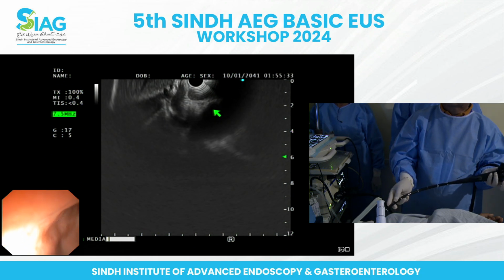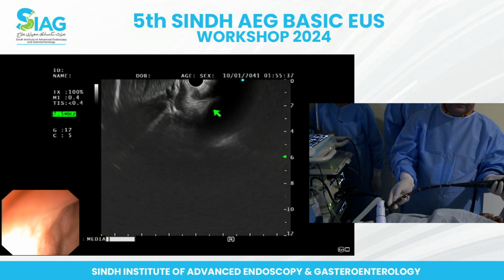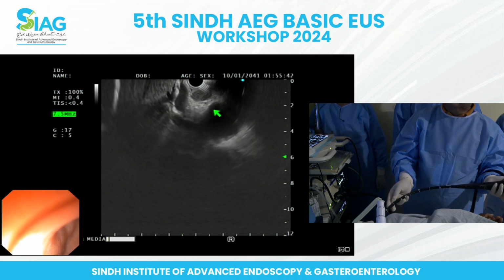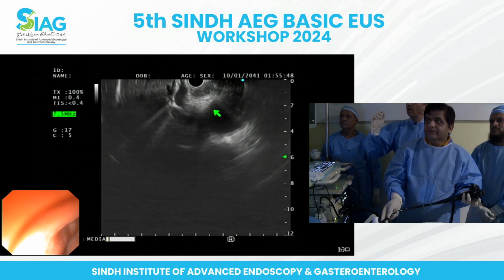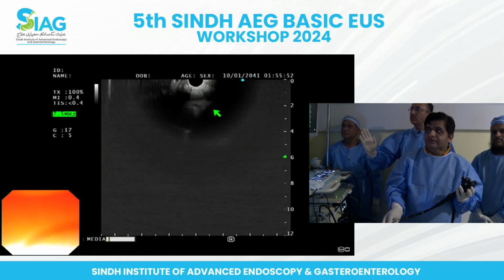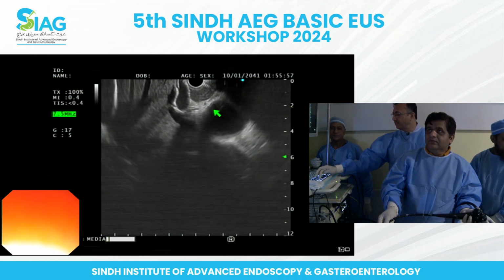Right. Are you injecting air? No, sir. Okay. So suck the air. Okay, you need to bring the, you see, your duct has to be underneath your transducer. So where's your duct? The duct that you are interested in.